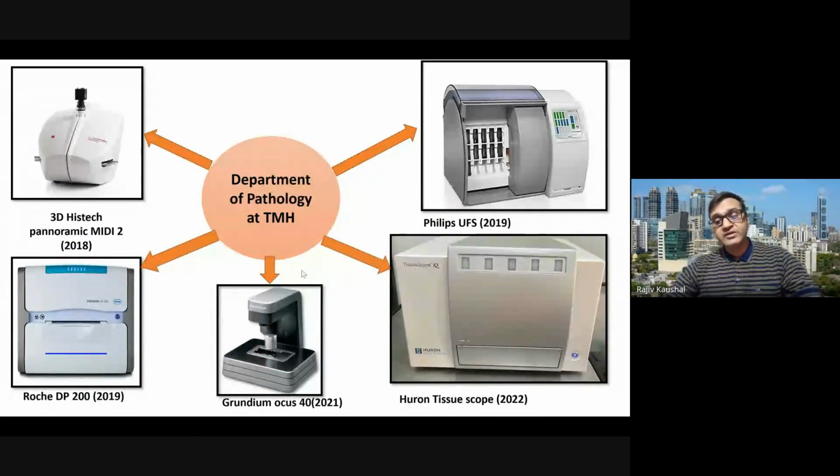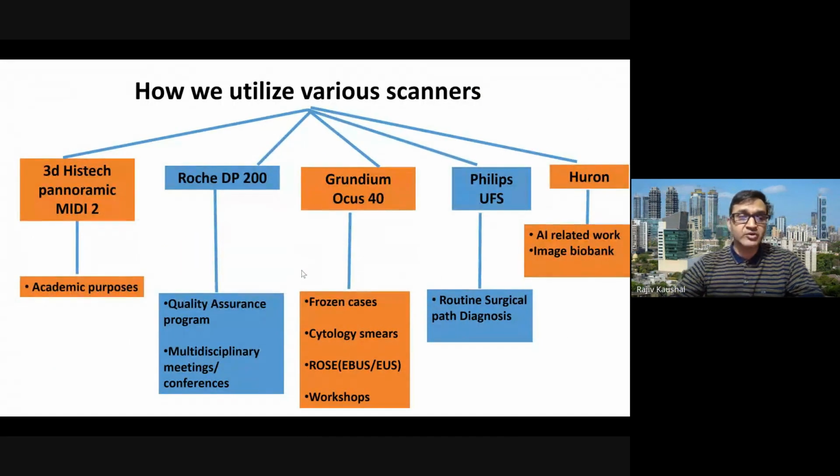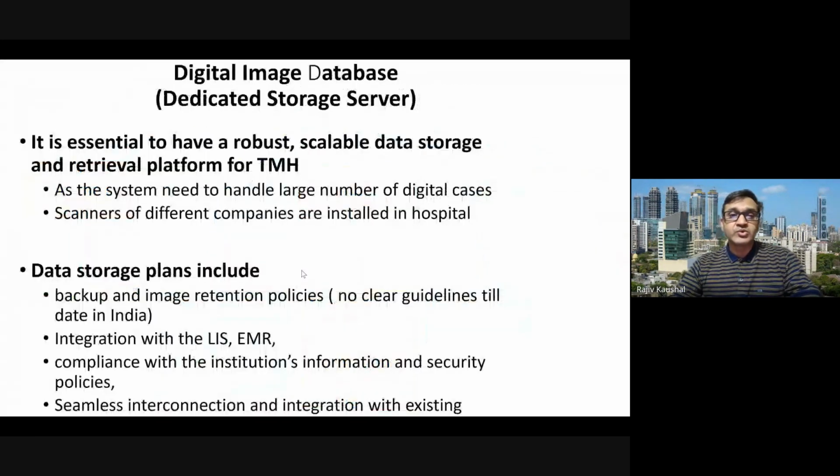Currently we have 5 systems in different capacities in our department, and depending on the initial evaluation, we use them for different clinical utility. So if you have multiple systems, you can dedicate them depending on your requirement, and also on the capability of one system over the other.